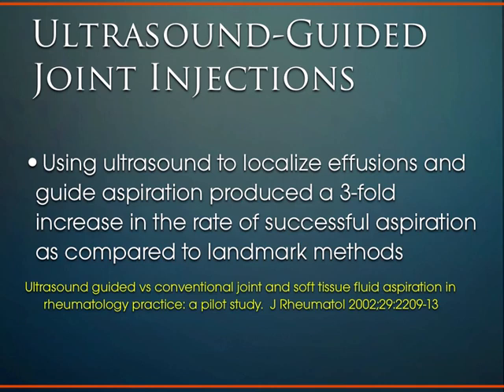You're not using fluoroscopy, which is a typical modality that guides injection treatment, but it's radiation exposure for not only the patient but also the practitioners who are doing it all day. You can't wheel the fluoroscopy machine in and out of all the rooms, and ultrasound guidance is very nice, very dynamic, and very useful.